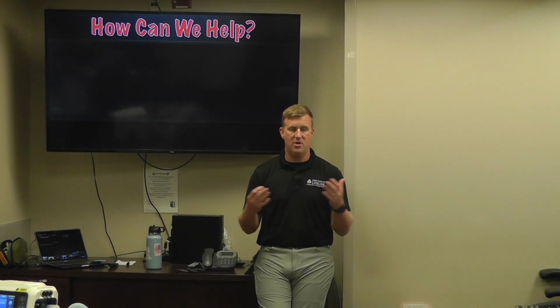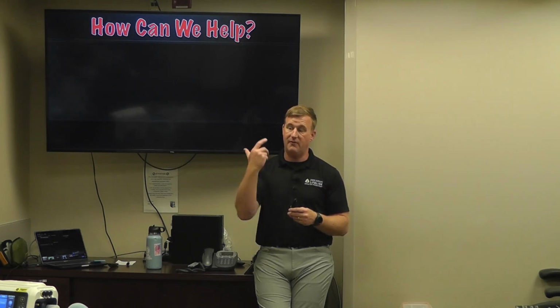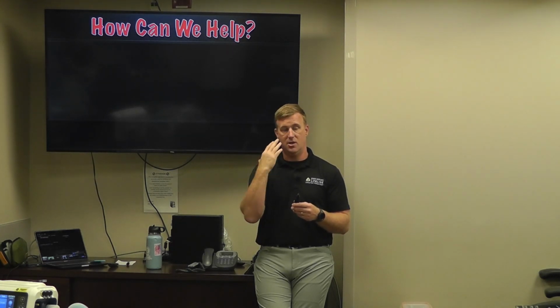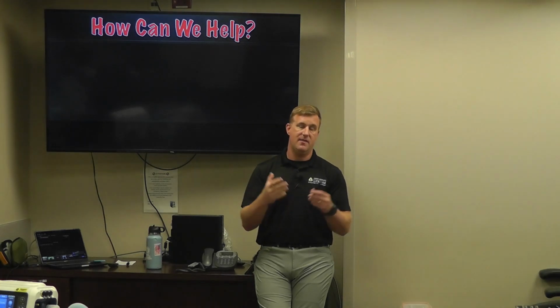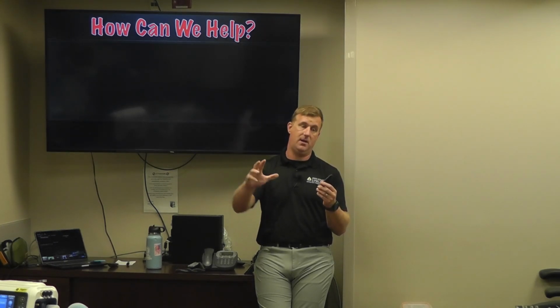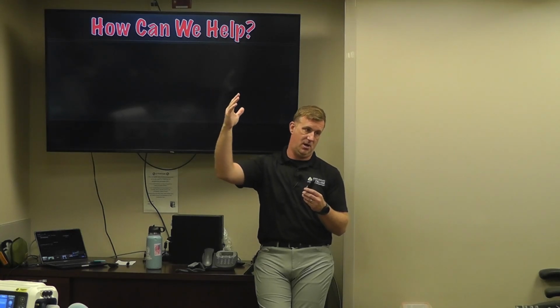How many of you guys wore an SCBA in this room? Okay. What happens when you take a breath with an SCBA on? That valve has to kick over, right? So it's not like there's constant flow blowing at you, at least on the SCBAs that I've worn. You don't have constant flow. There's a valve that you have to essentially trigger. That's BiPAP. So it's a constant pressure, you're there, and then when you trigger a breath, a valve in the ventilator kicks over and gives you an additional pressure. Okay? So it brings that pressure up.